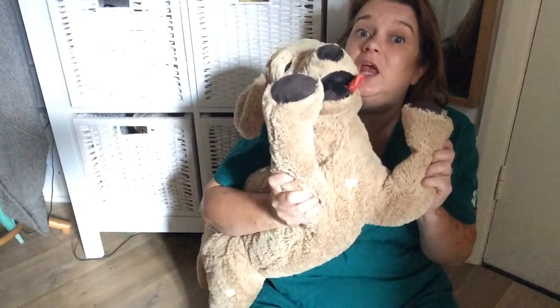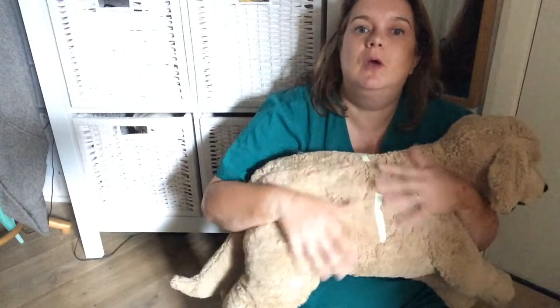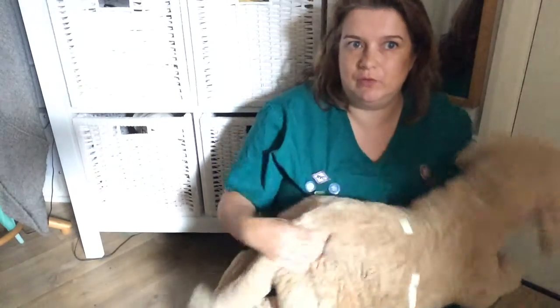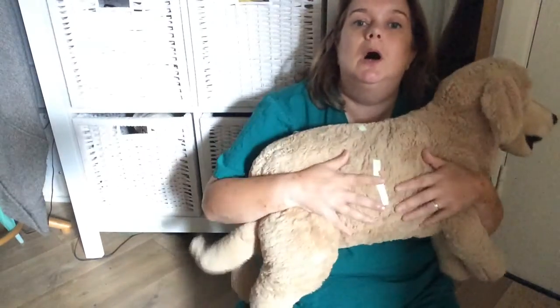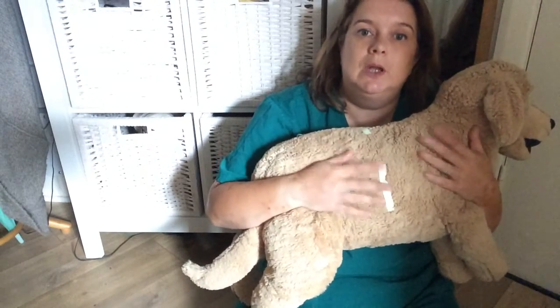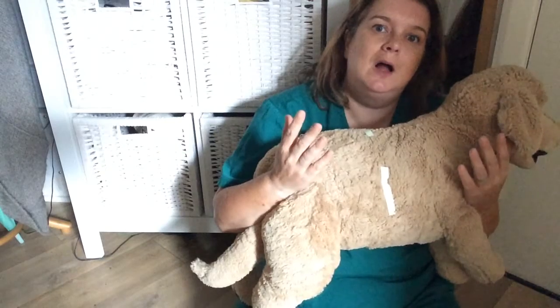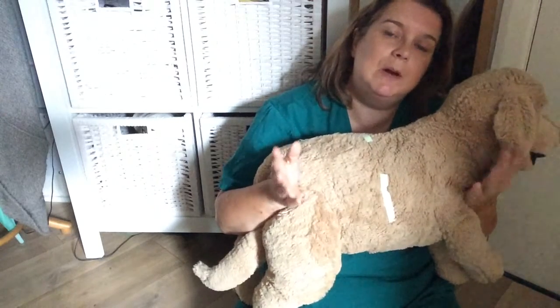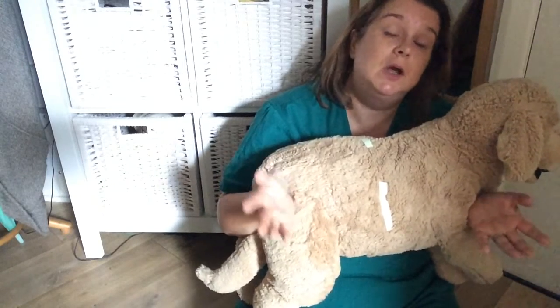Hi, it's Jane RBN and our little Swedish friend in our semi-darkened room for some more imaging. We've already gone through a few of the landmarks, so that's why we've already got some stickers on so when I put them in the dark you can see. I'd like now to do the cervical spine and the lumbar spine. People find this difficult because we all do spinal x-rays differently in practice depending on what level of equipment we've got.